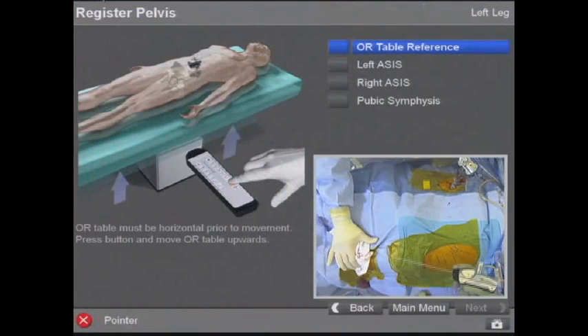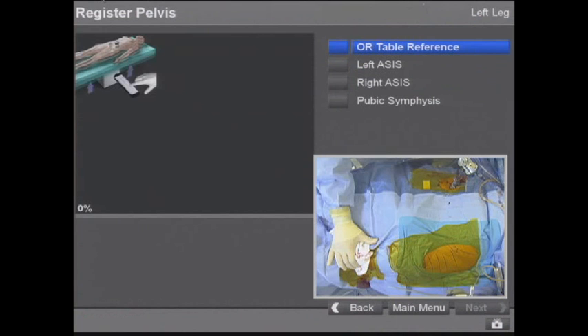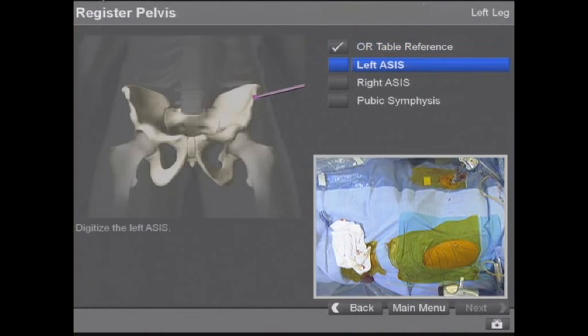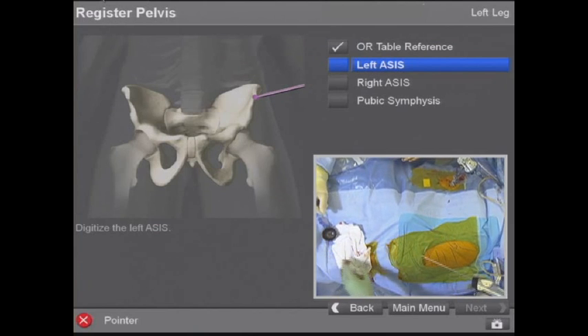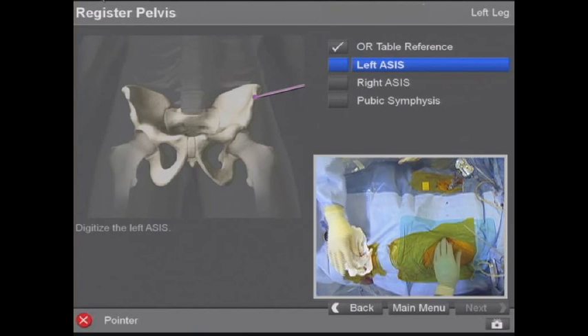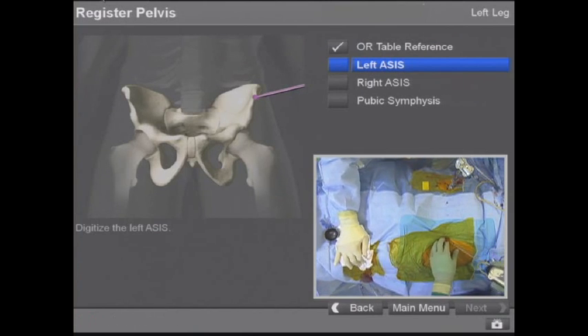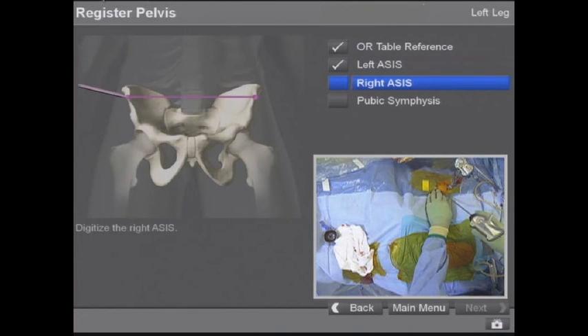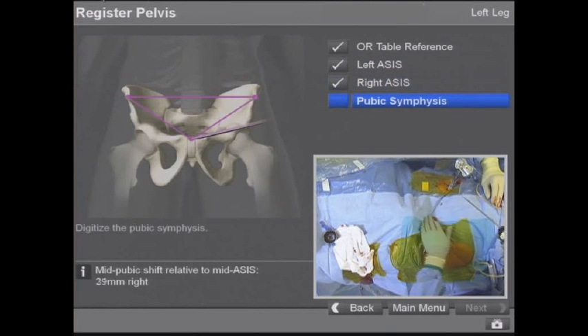Table up — okay, good — back down. Then the left ASIS first, right ASIS second, and the symphysis pubis.